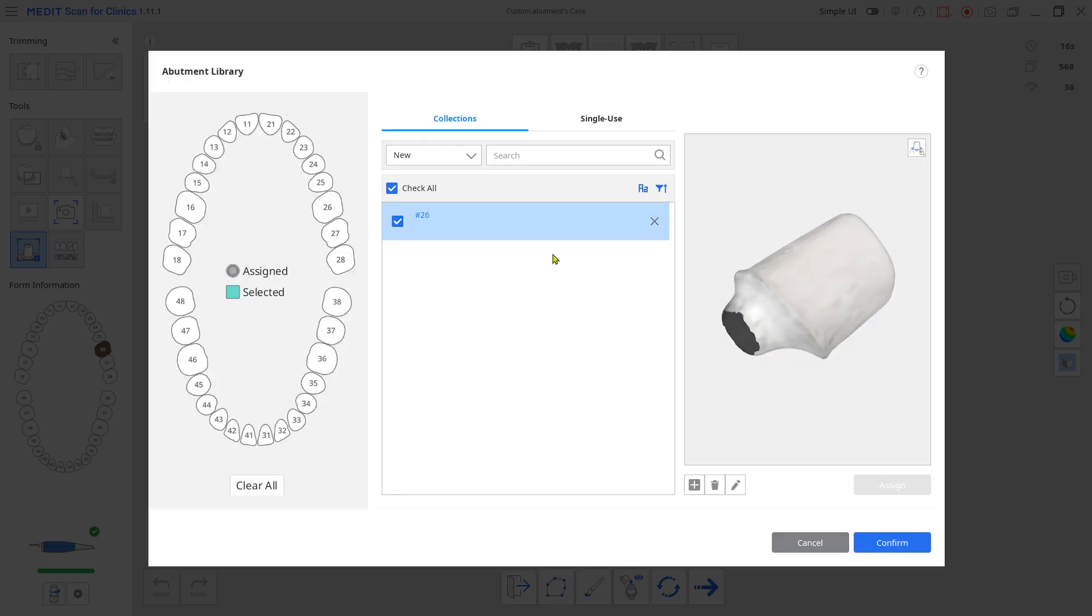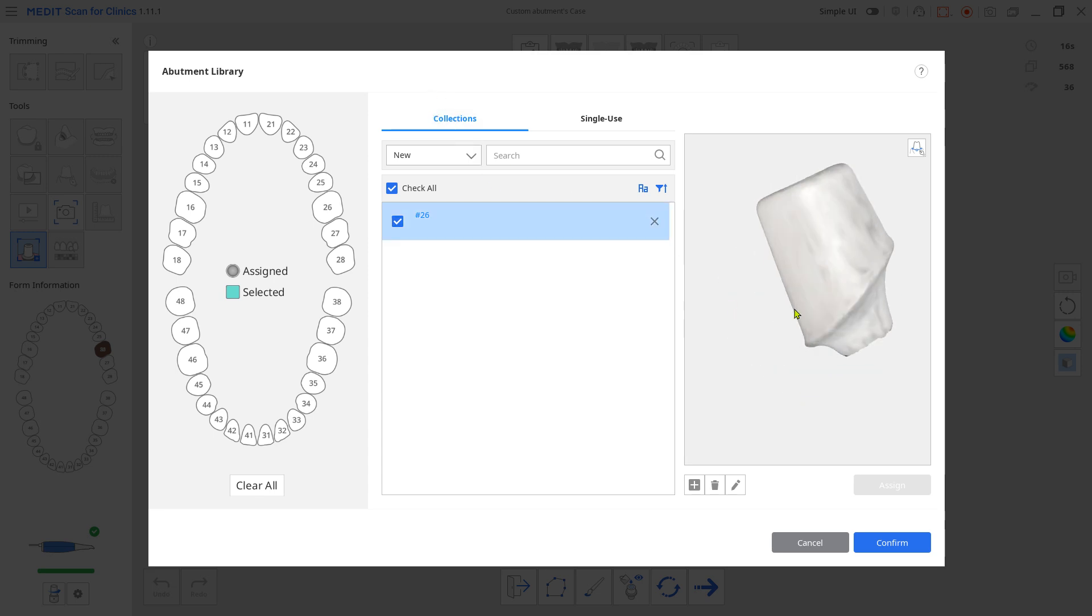Now that your abutment is listed, choose the corresponding teeth number from the left. Click Assign from the right. Click Confirm to exit.